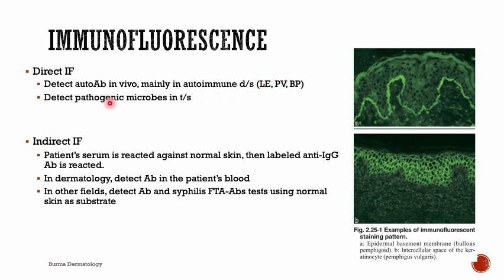It can also detect pathogenic microbial organisms in the tissue. And so it directly detects the antigen from the tissue of the skin, so the sensitivity is higher, about 90 to 100% in active diseases.